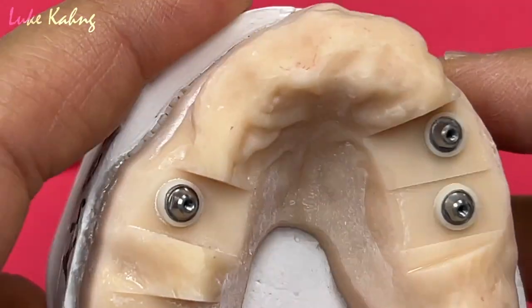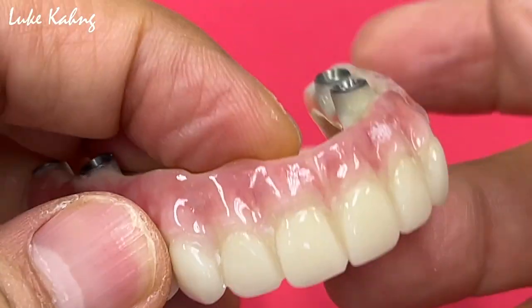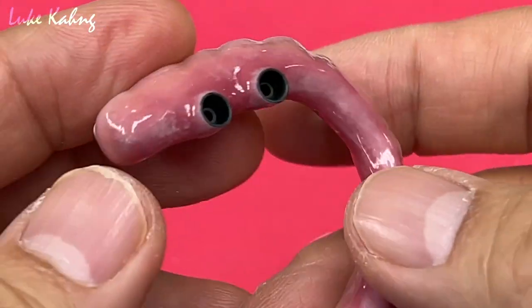Now, it's quite a big, huge span in between the two. So here's the story. PMMA from the STL file. Okay. This is what it looks like underneath.